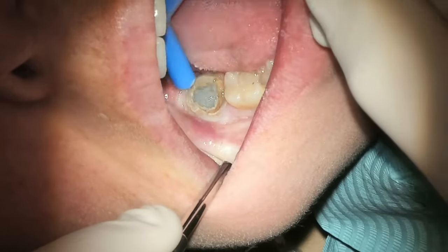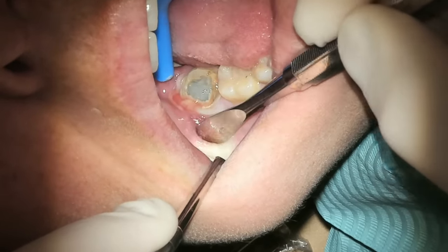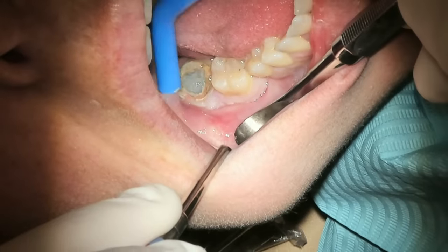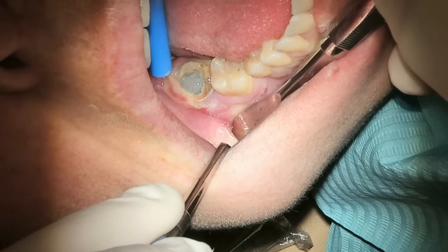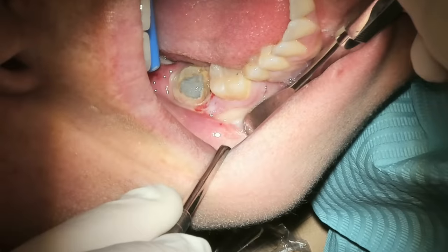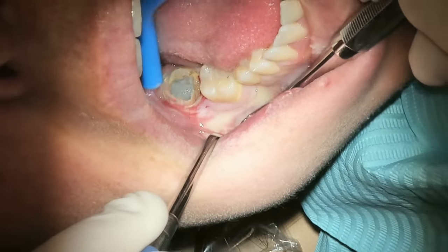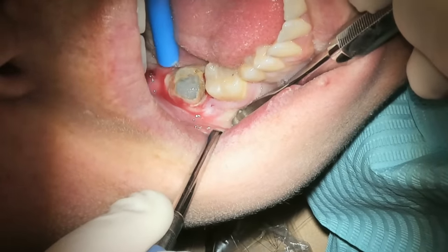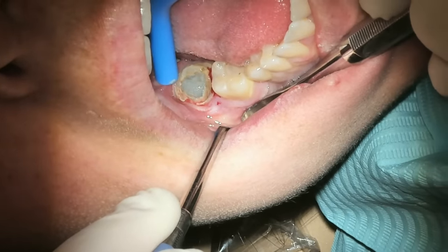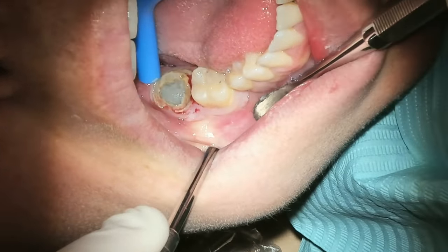So that infection is going to spread and start to swell up and travel to wherever it is easiest to spread to. We're going to start massaging that infection out, trying to remove as much of the swelling as possible and pushing out all the pus and dead bacteria in that area. Then we have to remove the source of infection, which is this tooth here.